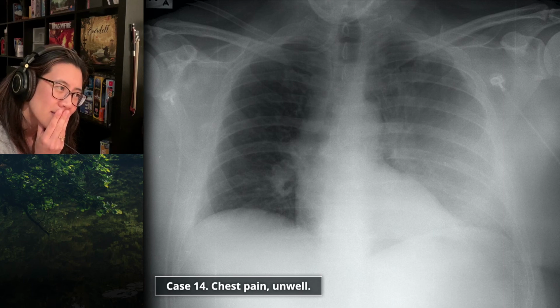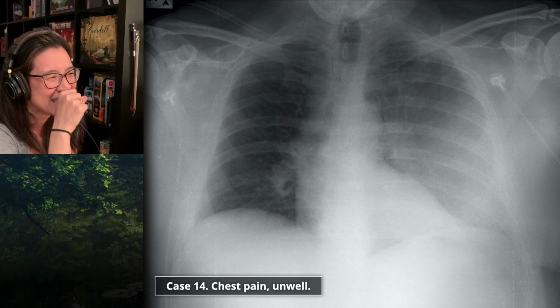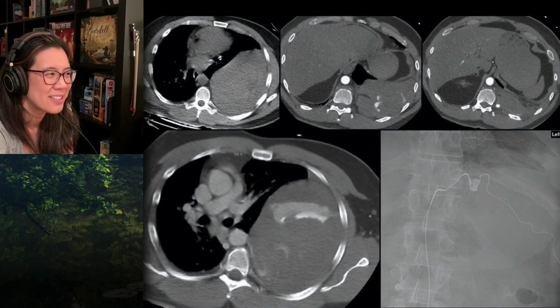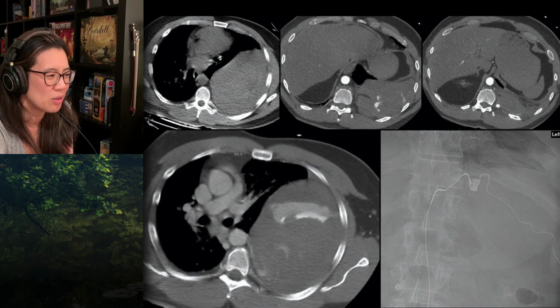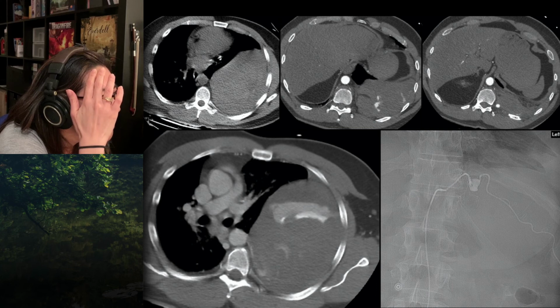I think they weren't certain if they wanted a CT angiogram, a CT pulmonary angiogram, or an aortic angiogram. So I decided, why don't we do a non-contrast scan first, and then we'll work out what we think. Okay. Is that next? Yeah, you can have the rest. You can have them all together. Oh, this is not good. So the first image is this non-contrast scan, and I decided he needed a CT angiogram. Yes, I think that's a very sensible call, Bob.